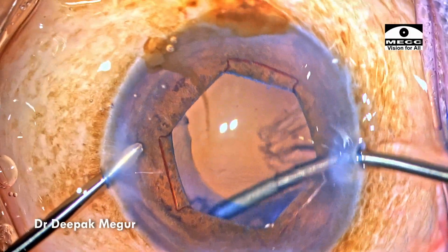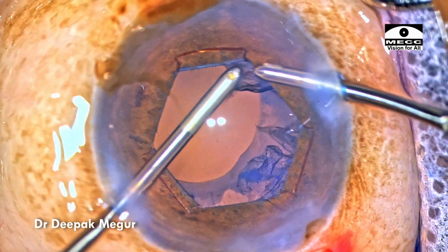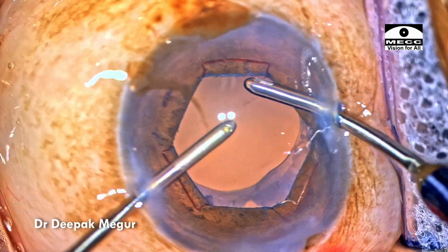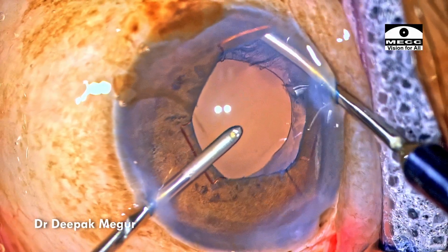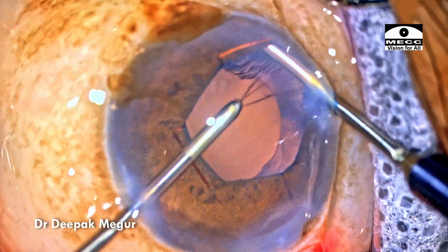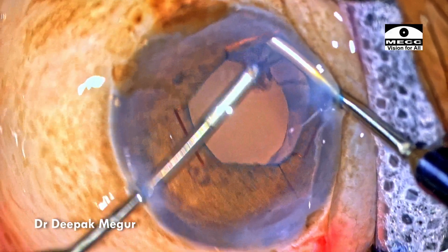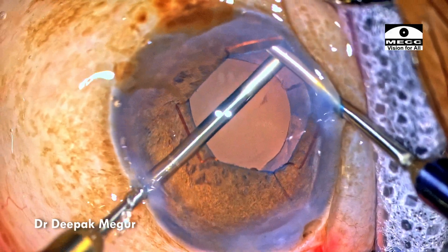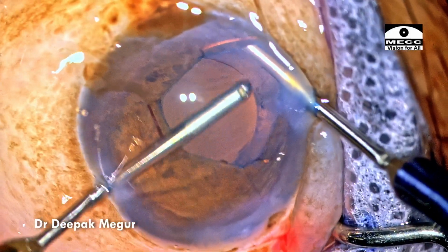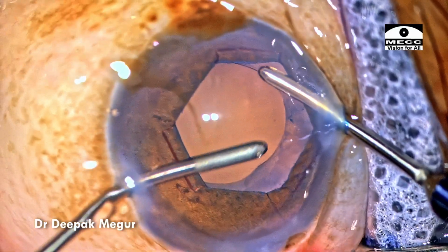So I'm going to use the IOL Trap Technique, wherein I'm going to place the haptics of the multi-piece lens into the sulcus, and the optic is then pushed back into the capsulorhexis margin. This has been my go-to technique in these eyes with generalized zonular weakness, and they have served me pretty well. I've been using them for the last 5-6 years, and thankfully until now, I haven't had a case where the lens has dropped back. Eventually it might, but hopefully the lens in the position outlives the life of the patient.